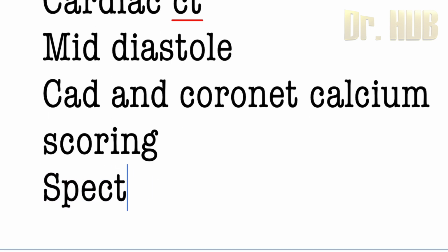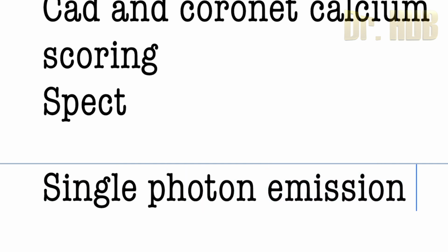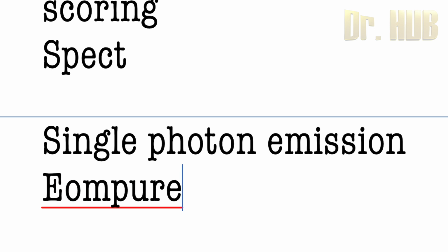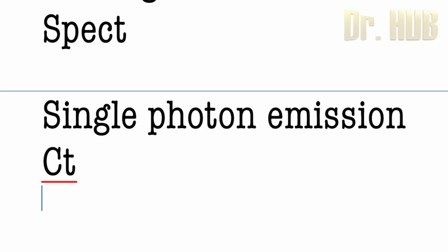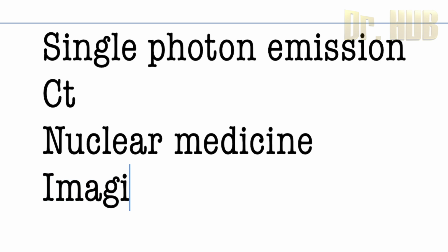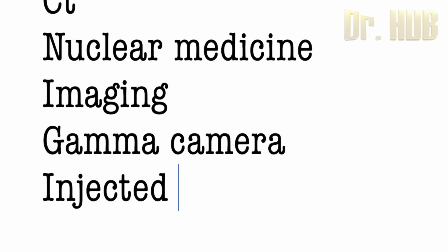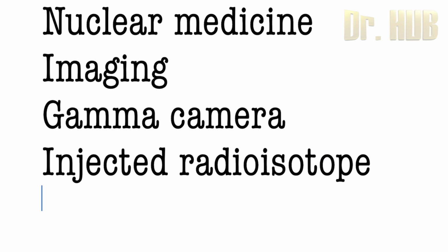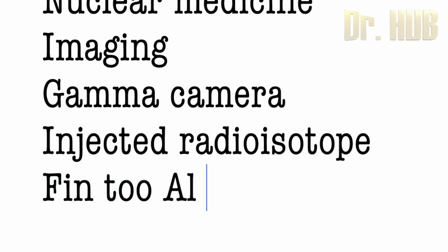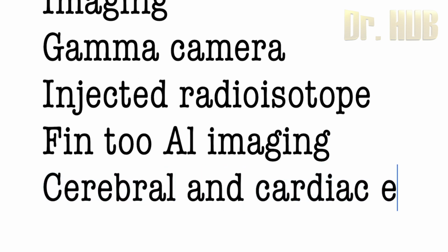Now let's move on to the SPECT. SPECT is single photon emission computed tomography. This is a nuclear medicine imaging technique. It uses a gamma camera to image the injected radioisotope. It is used for functional imaging of the cerebral and also the cardiac perfusion.